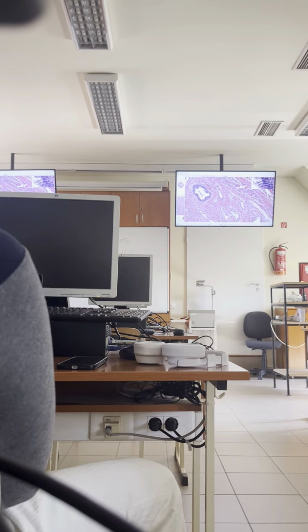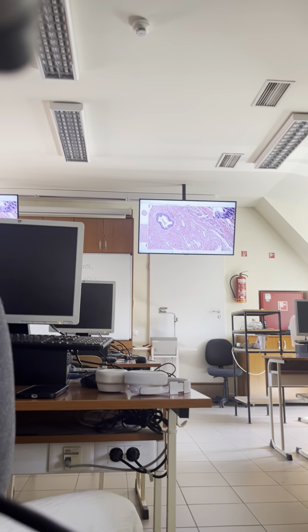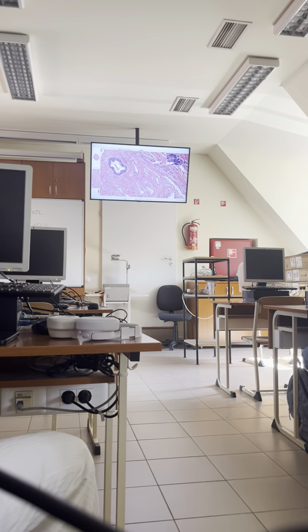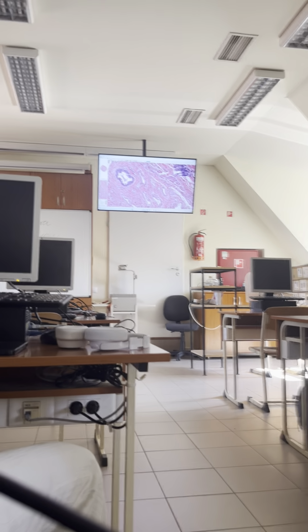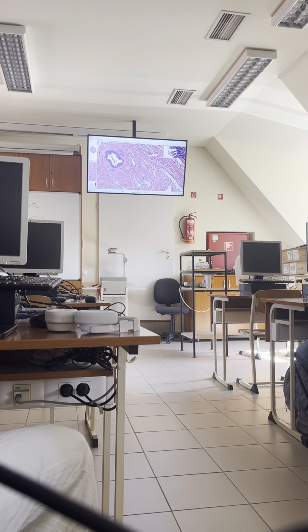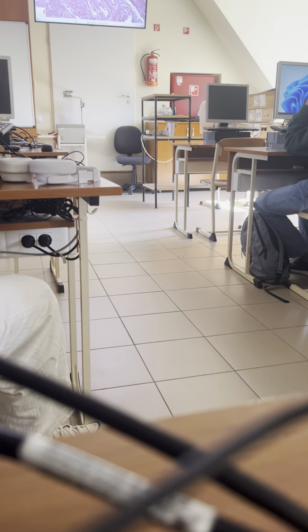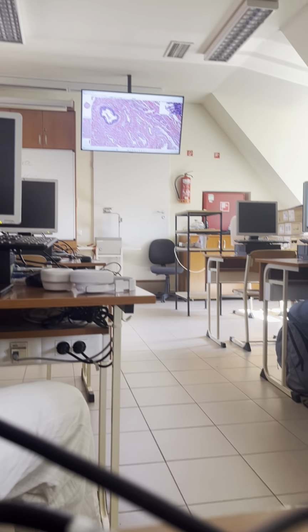I believe that this is one example for such a paraurethral duct. Inside the lining epithelium of the paraurethral duct, you may also find endoepithelial glands, which may therefore be termed paraurethral glands.